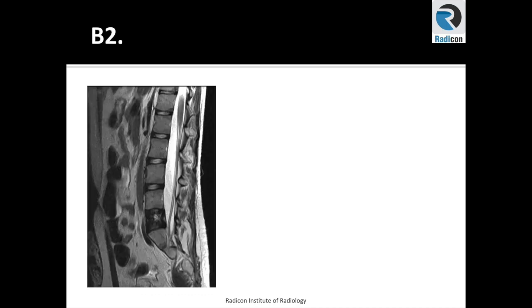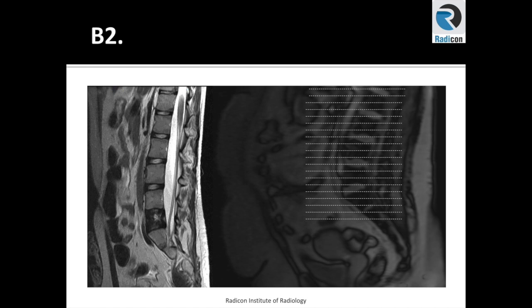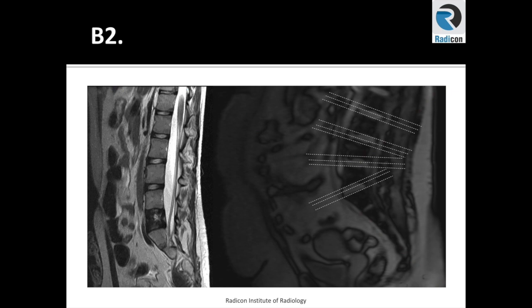Let's have a look at this case — it is a great example of a congenital anomaly seen on sagittal sequences. Here, L5 signal intensity appears dark. Please note that sagittal sequences may be your only chance to pick it up, as most axial acquisitions are no longer volume blocks. Slices are taken at disc angles and do not include pedicles or vertebral bodies, so axial slices might not show any vertebral body anomalies. You will have to rely on scouts, scanograms, or sagittal slices.